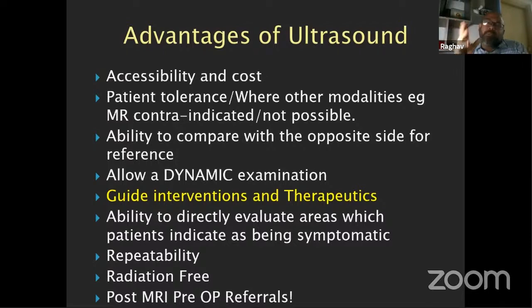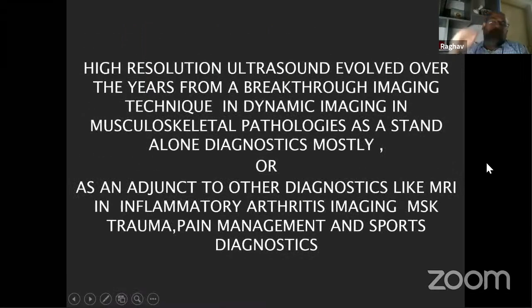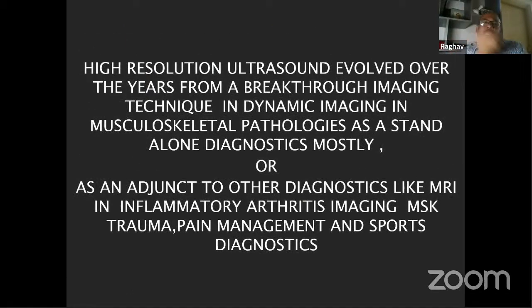Also, ultrasound normally is used as a segmental approach in the foot and ankle. We mostly use it as a problem-solving technique rather than a standalone technique. MSK ultrasound started way back in the 70s, then MR took over. Then the rheumatologists and the orthopedics kept it for us, and then the radiologists learned it. It is generally an adjunct, and we get referrals for the foot and ankle from the rheumatologist, the sports consultant, and the orthopedics. It is generally an adjunct to MR, to skiagrams, to the CT scan. It can be following them, it can be preceding them.